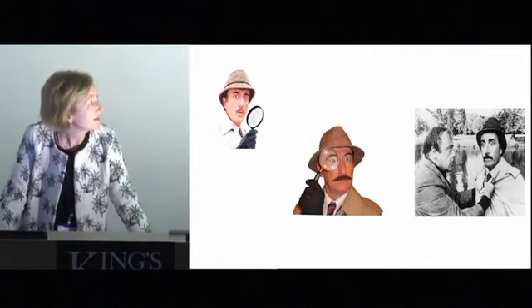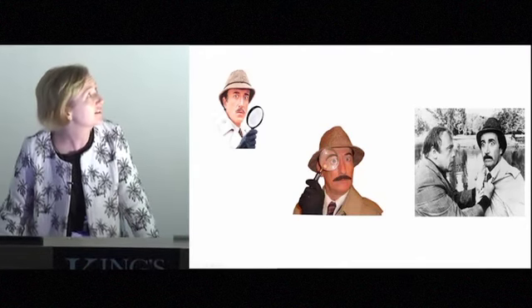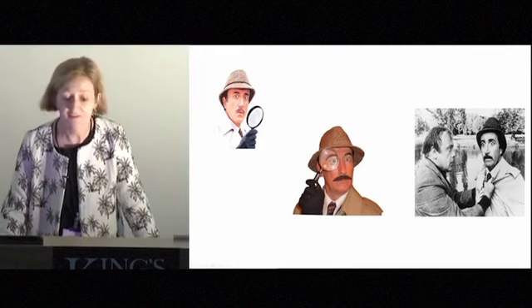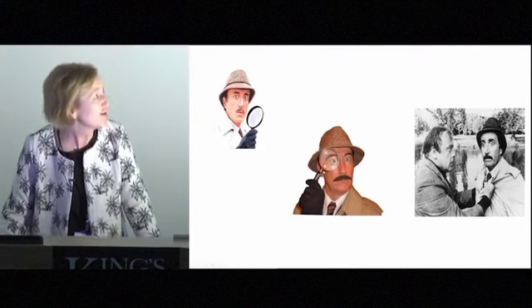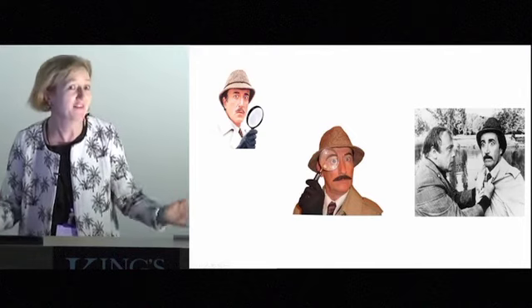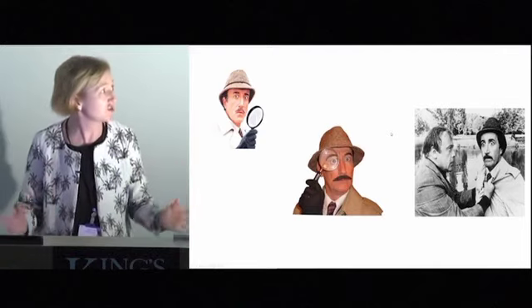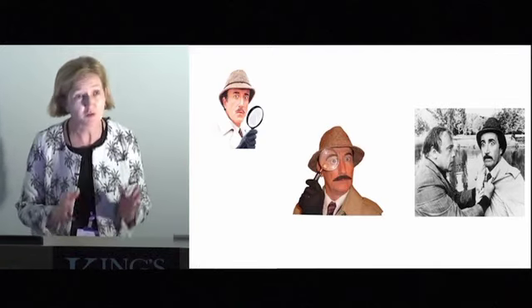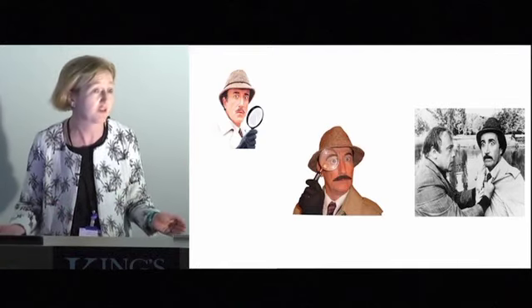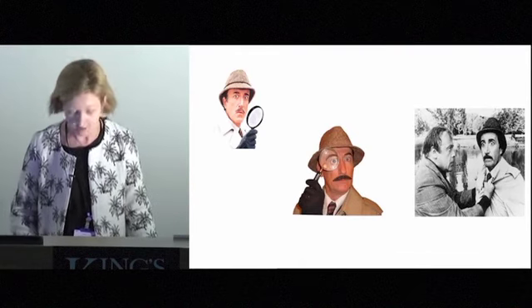So what do you do when you're scanning the patient and they're staring at your face and you say, I think I see a liver lesion, and then you look a bit closer and you think, I definitely see a liver lesion. And then the patient is at this stage hysterical, wanting to know what's going to happen to me, doctor. So you have to have some sort of an imaging strategy or a treatment strategy for these patients before they leave your ultrasound room so that they don't go off, obviously, and commit suicide or worse as they wait for their next test.